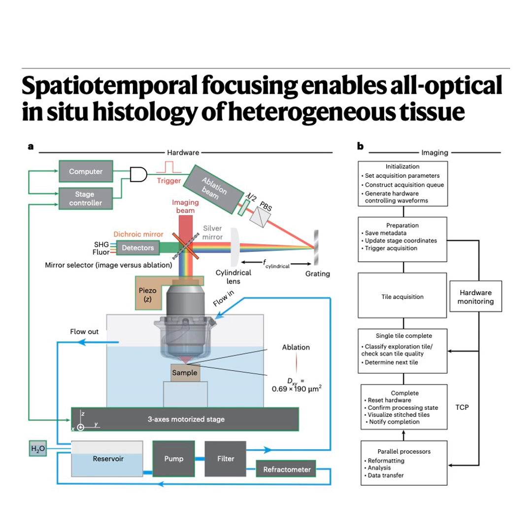The software considers all the distinct regions, the voxels or groups of voxels, that need to be ablated on that layer as the cities the laser focus needs to visit. Oh. It then uses a well-known optimization algorithm, specifically a 2-opt algorithm mentioned in the sources, to calculate the shortest possible path for the laser scanner to travel to cover all those target regions. So it minimizes wasted movement and time, maximizing the cutting speed for that layer. Precisely. Efficiency is built right into the physical path planning of the laser beam.